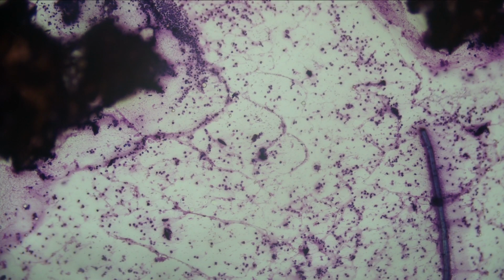Clinically, by EUS examination, such a small lesion, adenocarcinoma should not necrose. That's one thing to begin. And second is you still will be able to see some viable cells in there. So I don't think it's an adenocarcinoma.